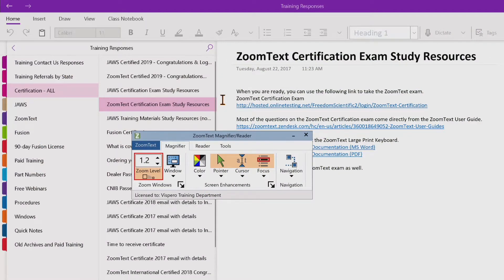Color enhancements in ZoomText improve the clarity of text and graphics, providing easier viewing and reduced eye strain. The color enhancement options consist of a variety of filter effects that adjust color, contrast and brightness. You can choose from preset color schemes or create your own custom color settings. Color enhancement options are enabled and set using the color split button control located on the magnifier toolbar tab.